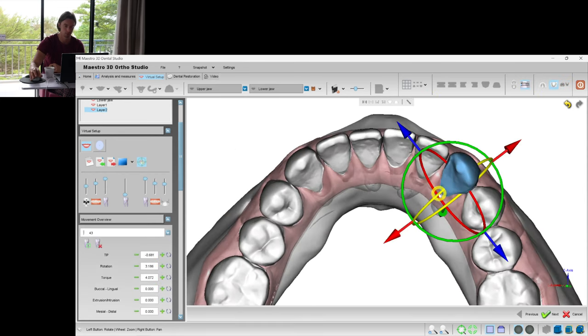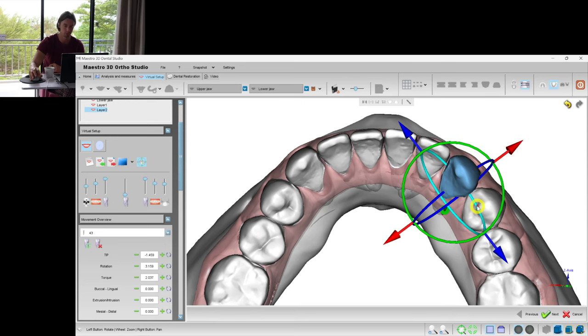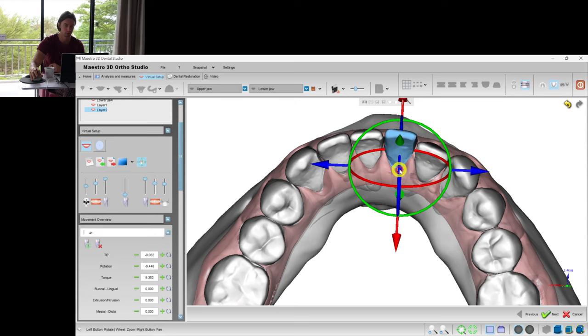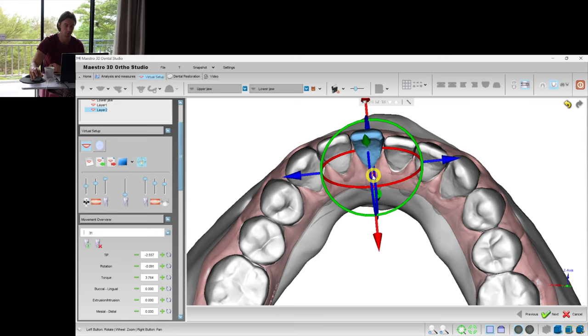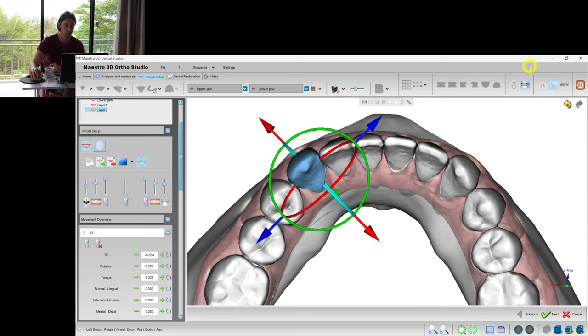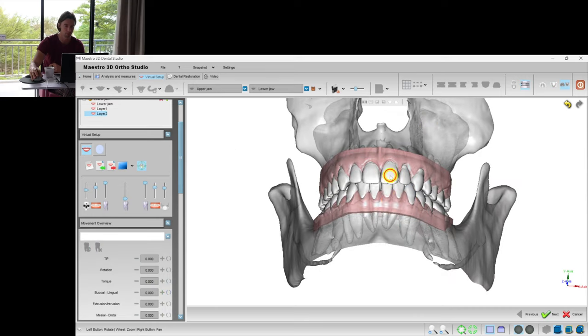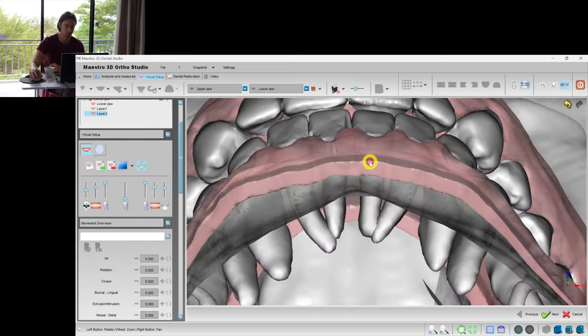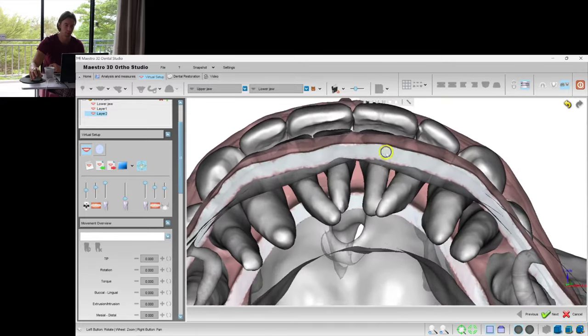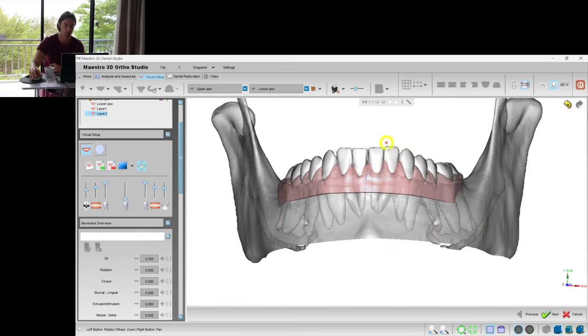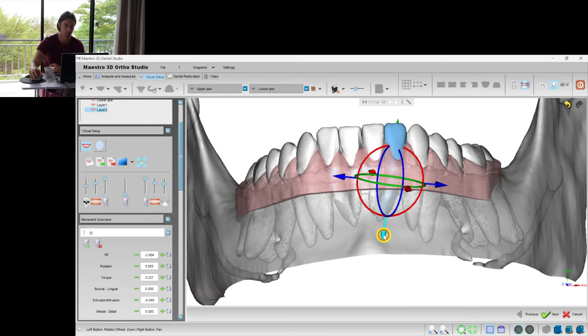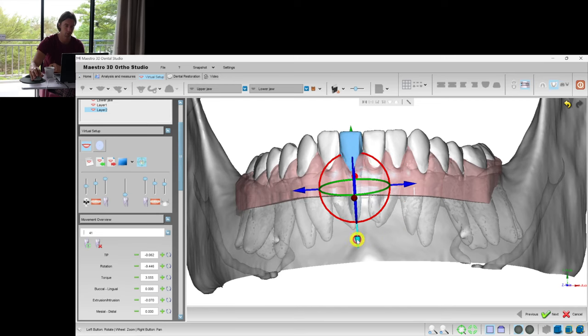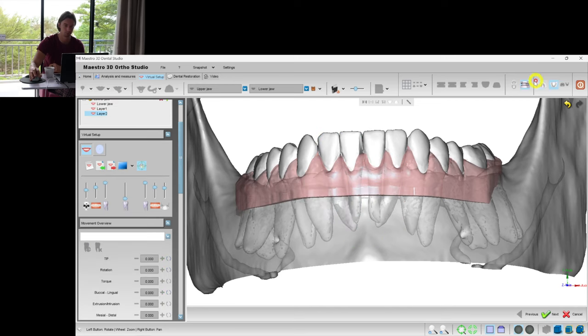And now let's adjust the lower teeth. Set them into a straight position, avoid the collisions with the upper teeth. Some minor sagittal gap is okay.